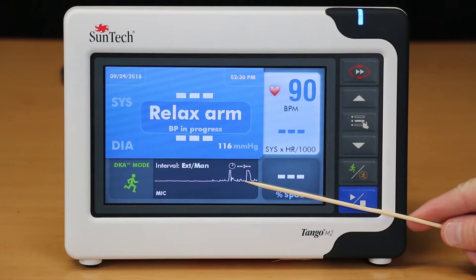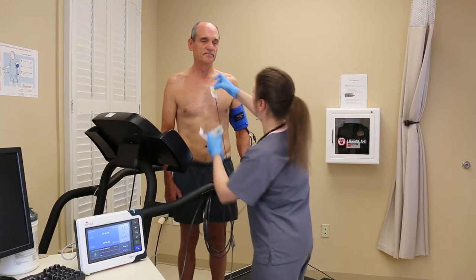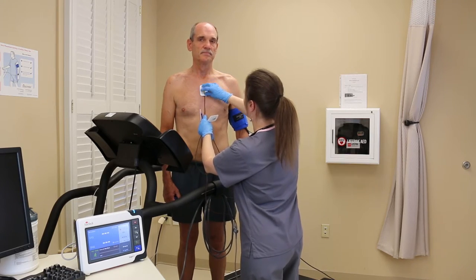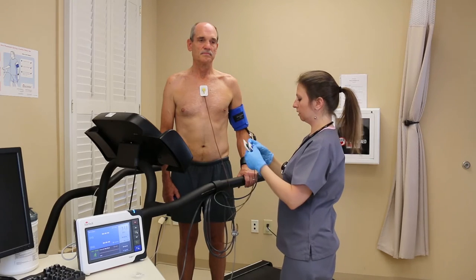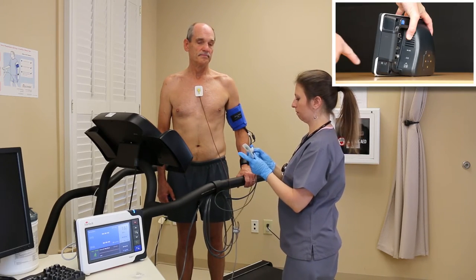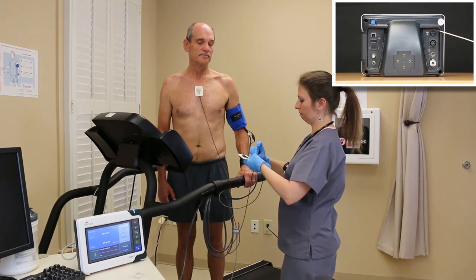If you are not able to see the K sounds and have already tried all of the troubleshooting tips mentioned during this video, please contact customer service at SunTech Medical. For those of you who have a Tango M2 with internal ECG, you will need to test this by applying the ECG leads to your patient in order to test that the ECG function is working properly. For more information on this option, please watch the video in this series entitled Assembling Your Tango M2.